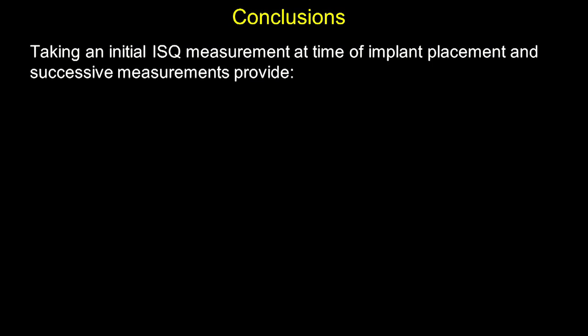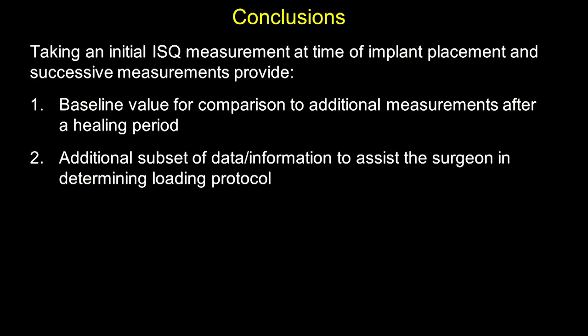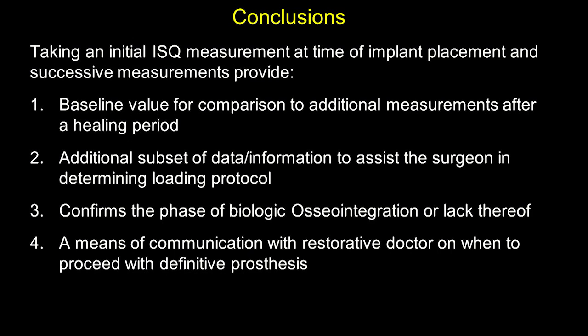definitive recommendation. So the importance of taking ISQ measurements initially and then successive ones is that it establishes a baseline value for comparison to additional measurements after a healing period, an additional subset of data or information to assist the clinician in determining the loading protocol. It confirms the phase of biologic osseointegration or lack thereof. It's a means of communication with the restorative doctor as to when to proceed with the definitive prosthesis.